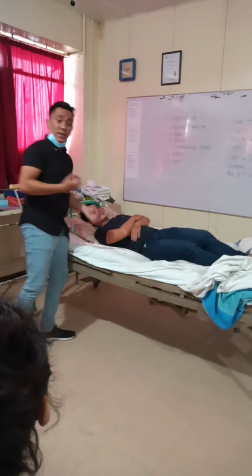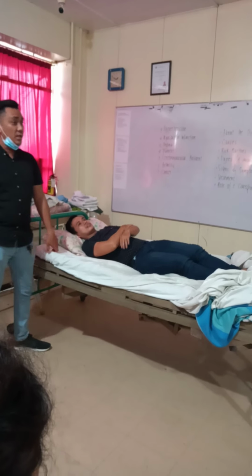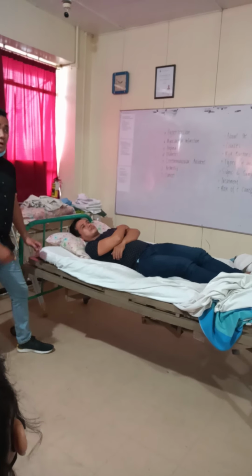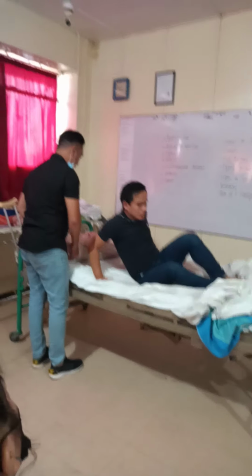Now if you cannot carry your patient, you really need to take it step by step. If you really can't, you can use slide sheets. Later on, we'll be discussing slide sheets, which is a technique on how to move the patient. This is so we can concentrate on how to transfer the patient to the wheelchair.